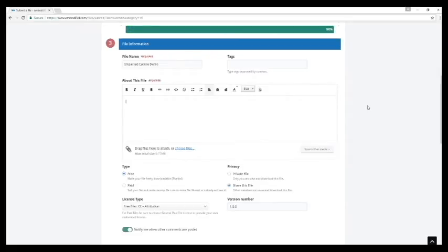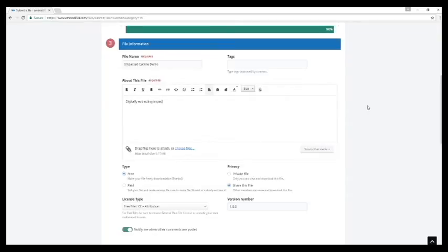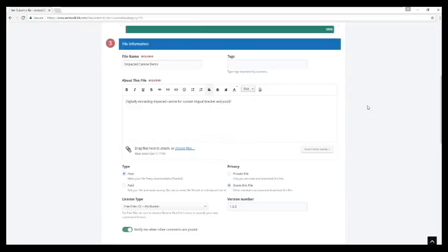So we will need to add a little bit about the file. I will just say what we're doing here, and we are digitally extracting impacted canine for custom lingual bracket and pontic.